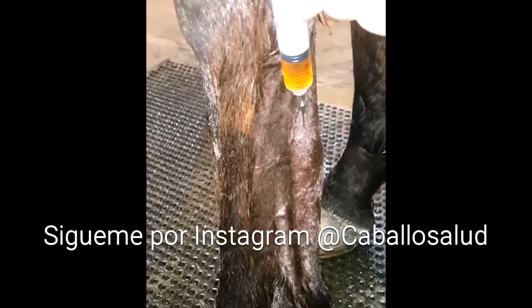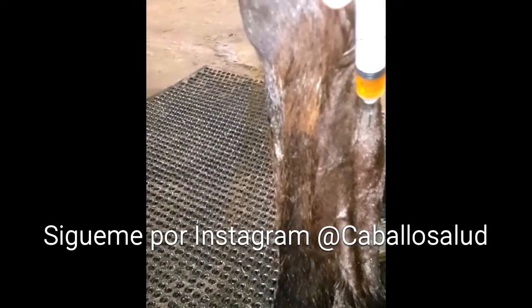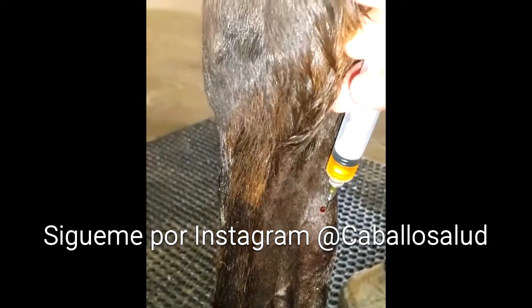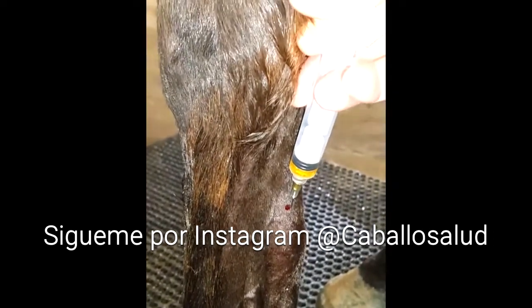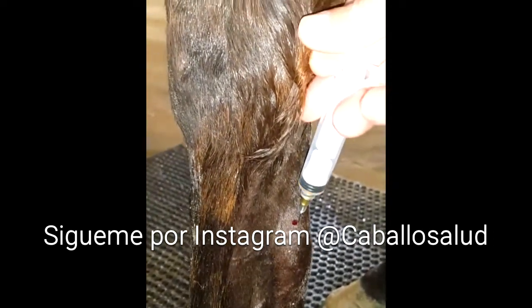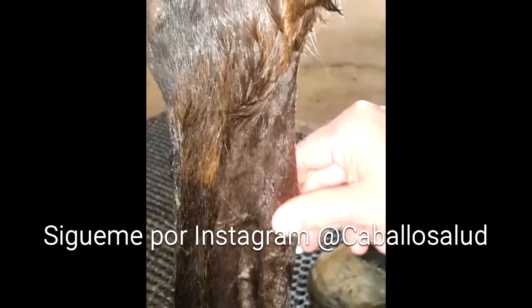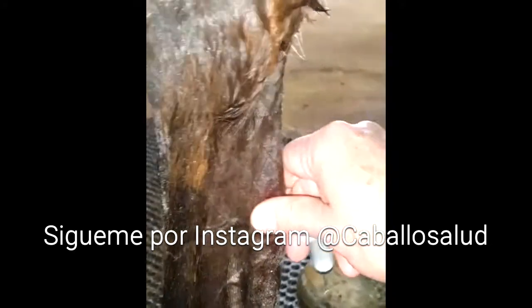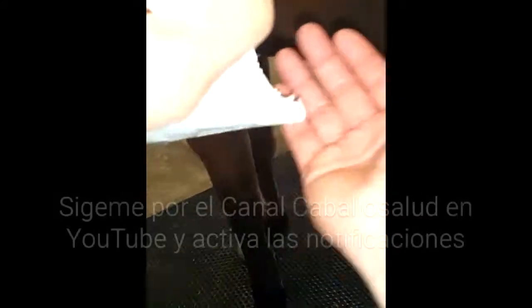Con cuidado — no me va a matar el caballo. Ahí se sacó la aguja, lo tuve que volver porque levantó la mano. El procedimiento lo pudieron ver claramente. Alhamdulillah, the horse didn't kill me — you could see the procedure.